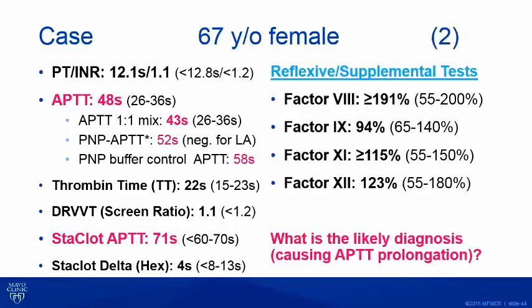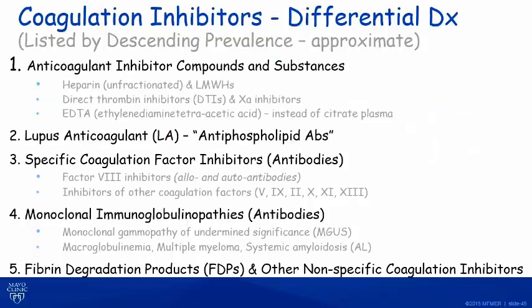All right. So let's rule out the factor inhibitor. The patient plasma inhibits the APTT-based assays, but the more you dilute the patient plasma, the more apparent activity. So the factor VIII was at least 191% and so forth. So it's not a factor VIII inhibitor. Therefore, what is it? It's not lupus. It's not a factor VIII inhibitor. We're now down to it's a direct anticoagulant, or what? Okay, we're toward the bottom of this list.